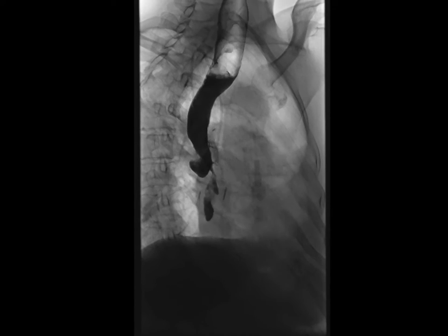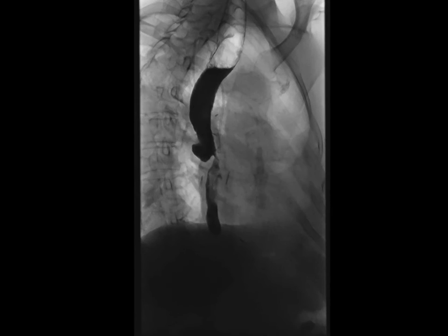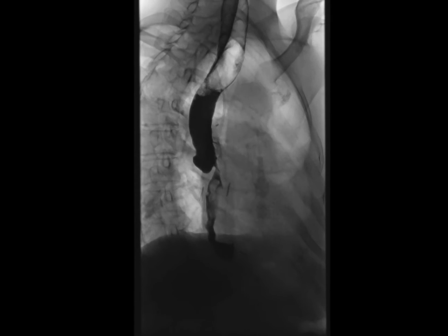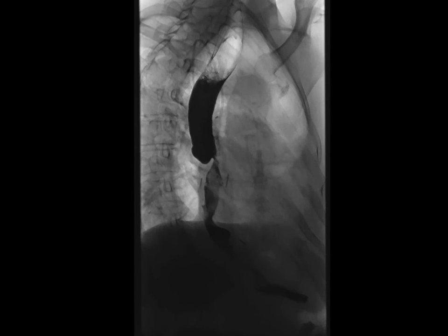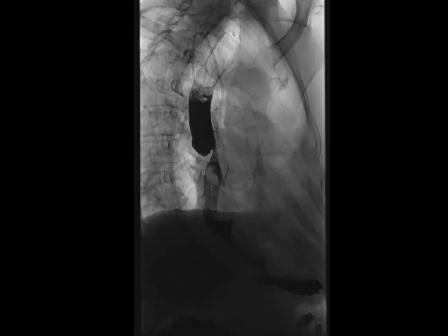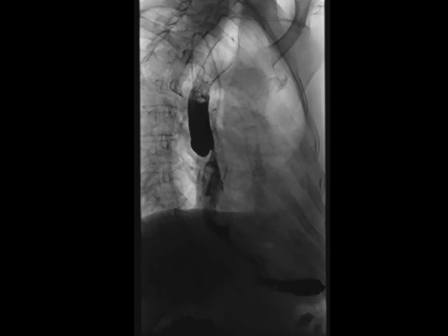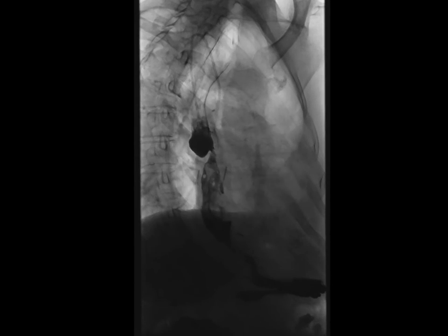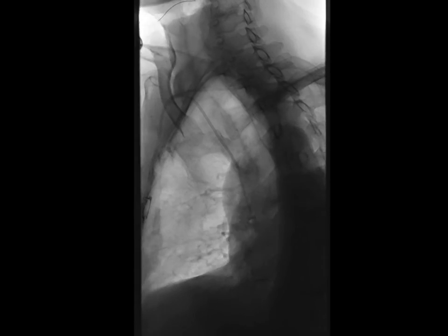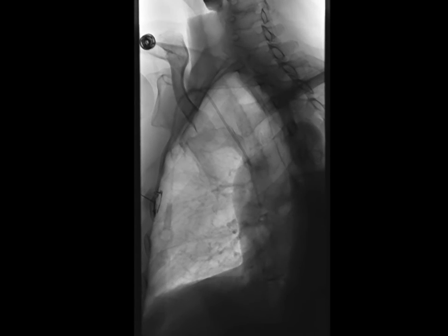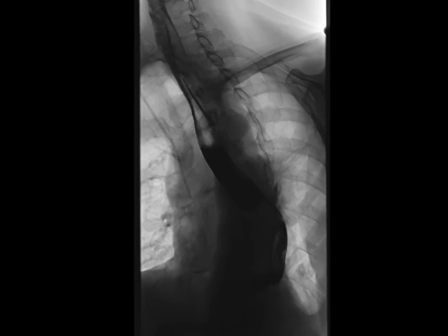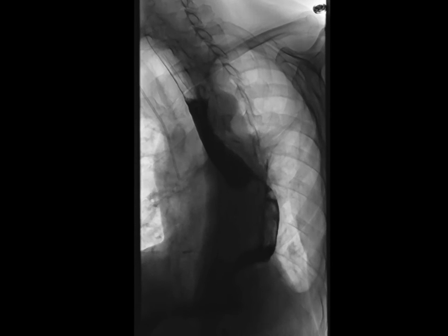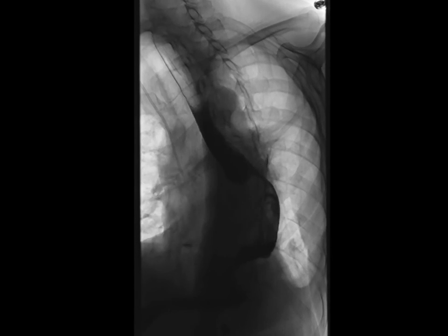we can see that there's a very discrete and persistent region of narrowing within the mid-to-distal esophagus. It's a short segment. Some of the contrast does get through, but there is a delay in contrast getting through that region, and some of it is held up just proximal to it. That persists across multiple swallows and across multiple positions as well. The patient has a very discrete stricture within the mid-to-distal esophagus.